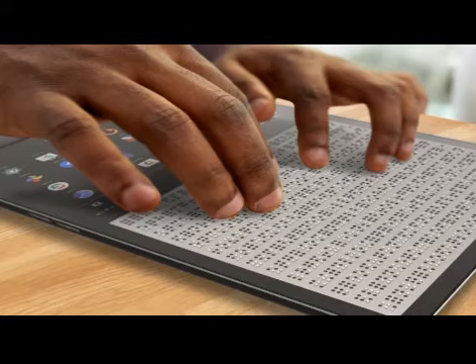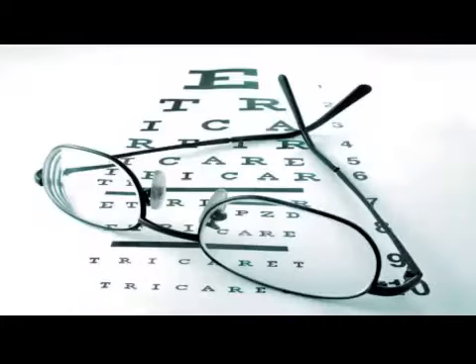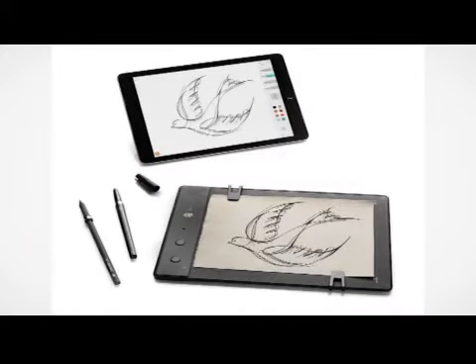Students, you might have learnt a number of devices used for Braille reading and writing. Let us briefly note some of the Braille devices in this lesson, in addition to optical devices for print reading by low vision students. To begin with, we list some of the devices for Braille reading. Slate and stylus is the most commonly used device in our country.